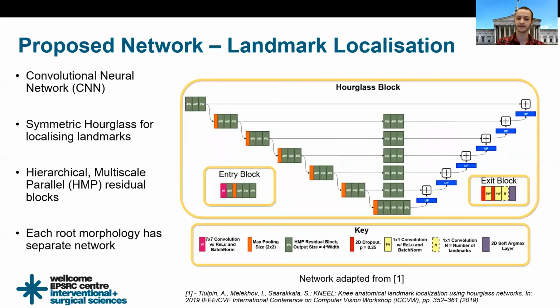Okay, this is the network we're using. It's a fully convolutional network. It's an hourglass network that's been adjusted from the cited paper. The cited paper used an asymmetric hourglass network, but we've adjusted it to be symmetric on each side, which conforms more closely to previous literature in body pose estimation, specifically for stacked hourglass and single hourglasses, which should be symmetric.